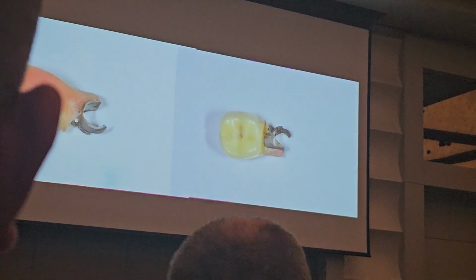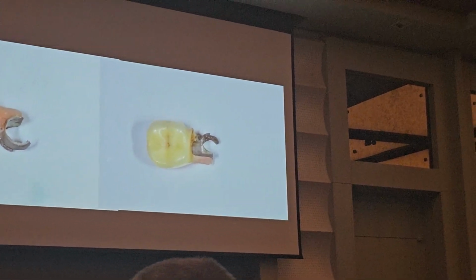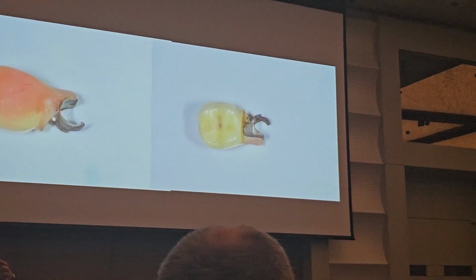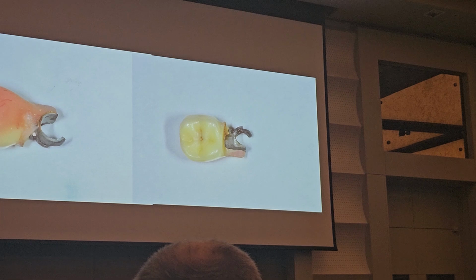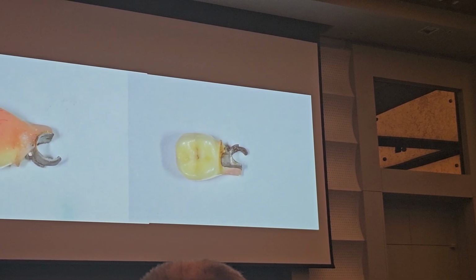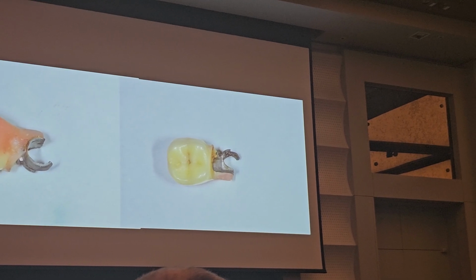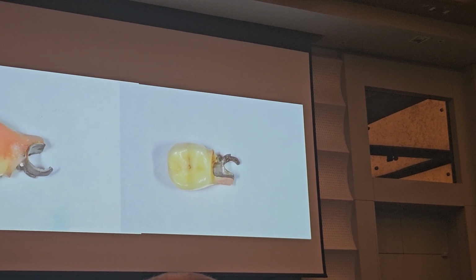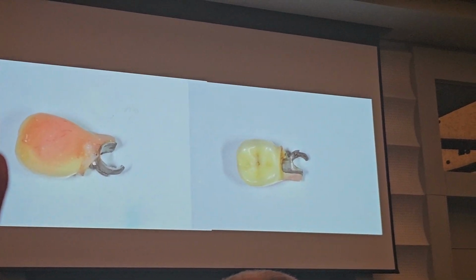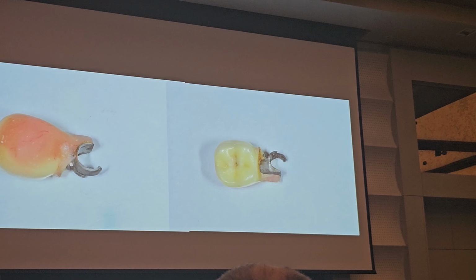But then, in 2023, I had another problem. I had a fracture of the lower prosthesis. You have a full arch case on the lower arch with the metal framework and the resin, and you have not a crack on the denture, but a crack on the metal. Yes, because if you do a metal of 0.3 or 0.4 millimeters, technician fault, it will be a disaster. The denture of 3 millimeters is stronger than 0.4 millimeter of metal that flexes every day.